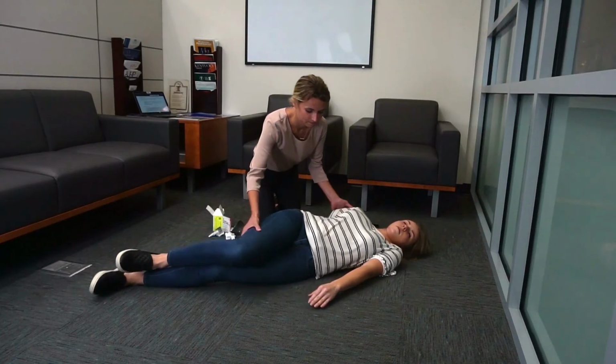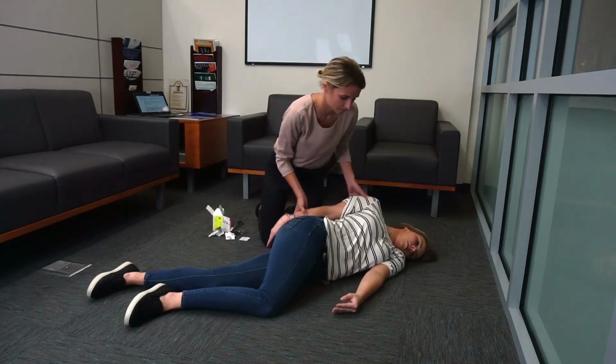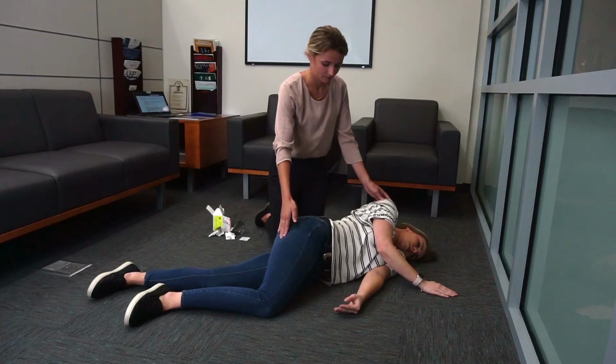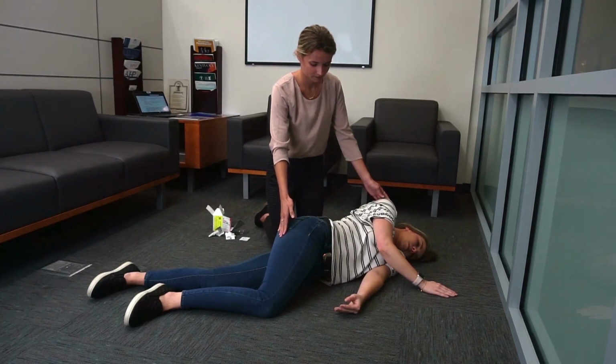Recovery position. If the patient starts to breathe again, or if you have to leave the person for any reason, put the person into the recovery position. Roll the person onto their left side with the knees bent and arms in front. This will keep them from falling onto their back and choking if they vomit.